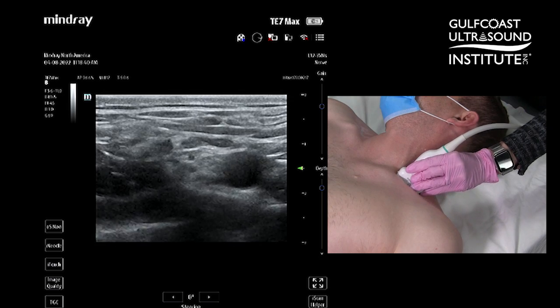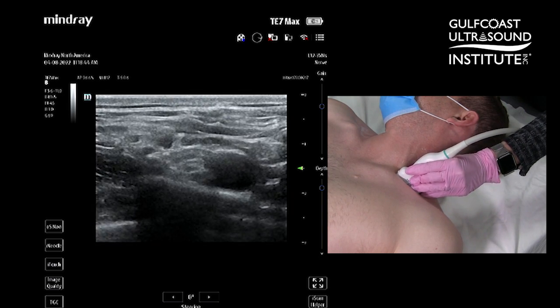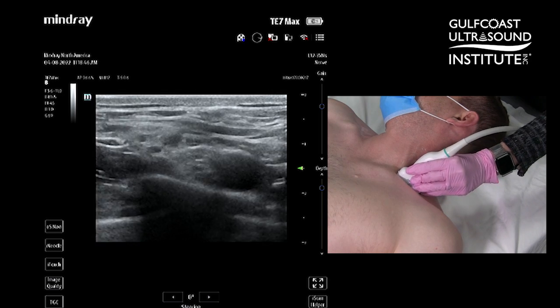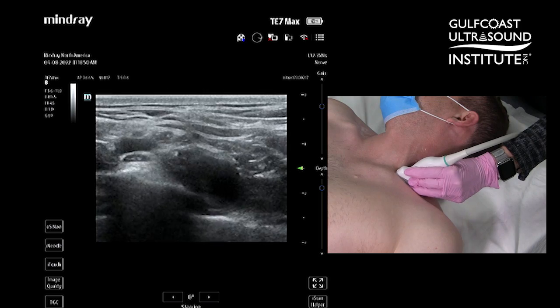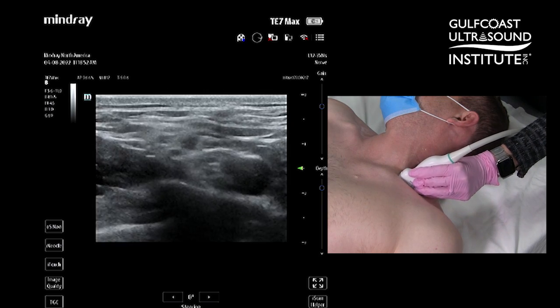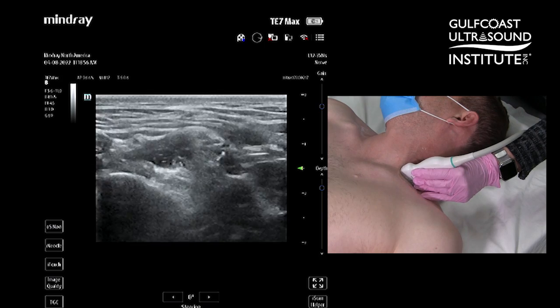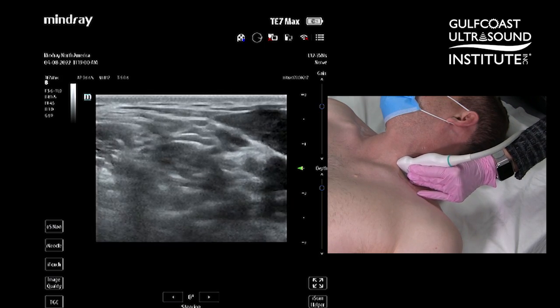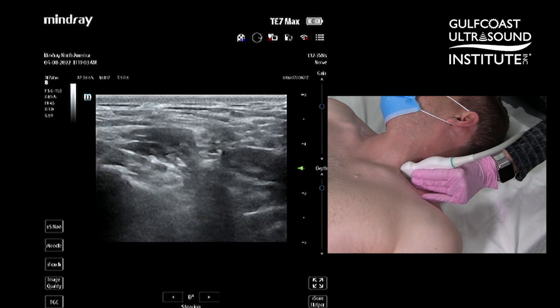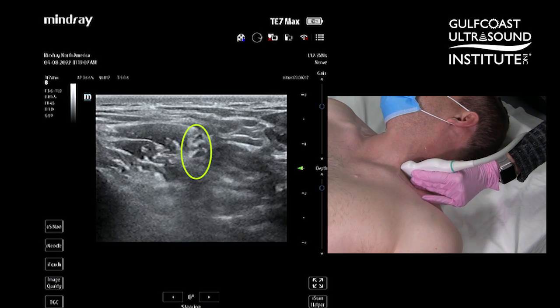Once you locate the rounded subclavian artery, you'll notice the nerves posterior lateral to the artery. Center the nerves on your screen, keep your probe perpendicular to the patient's neck, and then follow the nerves up the neck until you see the scalene muscles. Center them on your screen in between the anterior and middle scalene muscles.